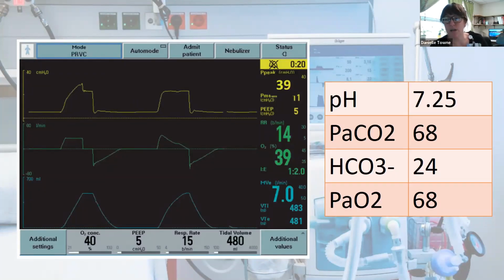All right, we know our PaO2 is too low. So that's telling us there's an oxygenation problem somewhere. What can we do? So there's the two things you can do for oxygenation problems, right? You either change your FiO2 or you change your PEEP. And how do we know what the best option here is? Well, for this patient, increasing our PEEP is guaranteed to increase our PIP. Remember that chart from earlier where anytime that you add in PEEP, it contributes to the overall PIP? So in this case, it's actually safer to only increase the FiO2 and reassess.